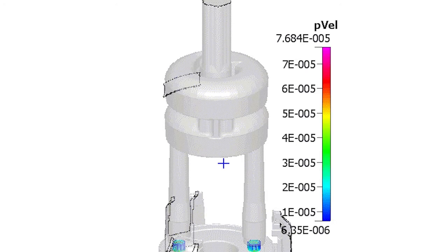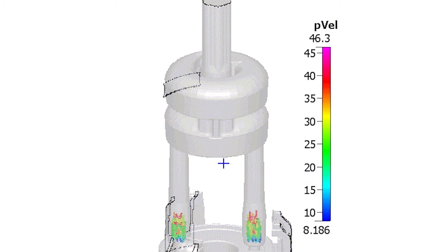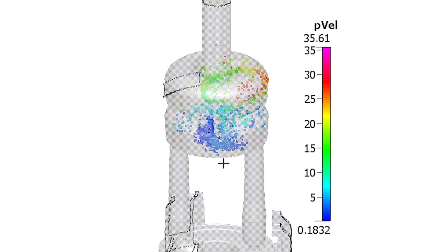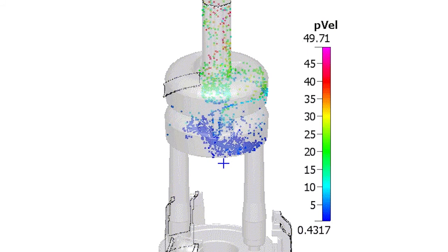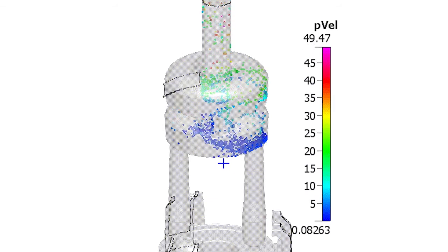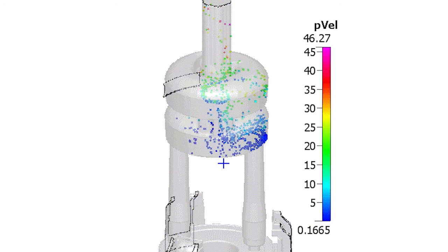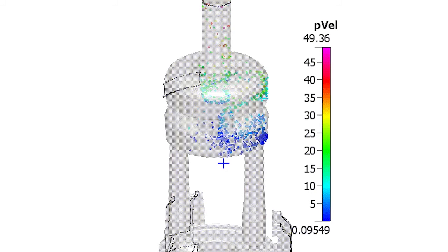We call our inhaler the polyflux collider. The polyflux portion of the name refers to the two individual streams of entrained agglomerates. The collider portion is the unique aspect of the patent, the forcing of the two flow streams into the face of each other. The theory being pursued was that we could get extreme particle-to-particle collisions, which further de-agglomerate the particles. Additionally, we theorized that some of the collisions would rebound into the oncoming flow stream to create new collisions and receive a second and perhaps third chance at de-agglomeration. So the polyflux collider effectively takes the available kinetic energy of the flowing particles and maximizes de-agglomeration.